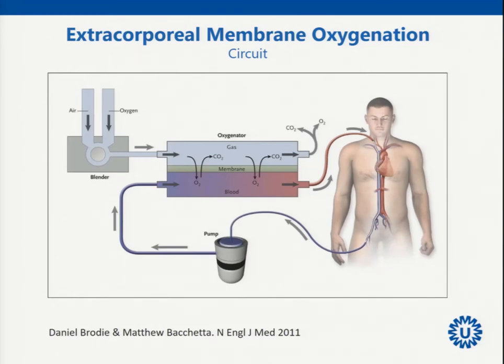And if you see this, you can imagine that if you increase the gas flow over the membrane, then something happens which is very similar to mechanical ventilation. You just increase the minute volume ventilation, or the tidal volume, if you will. So if the gas flow is increased, then CO2, which dissolves very easily across the membrane, will be exchanged from the blood to the gas. So that is something which is driven especially by the gas flow.